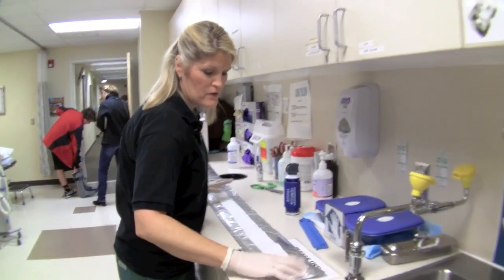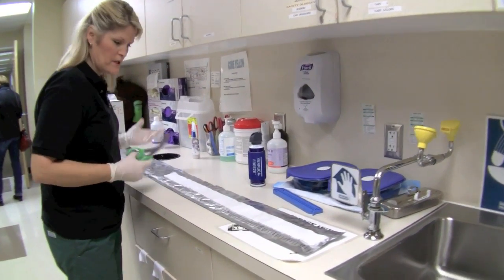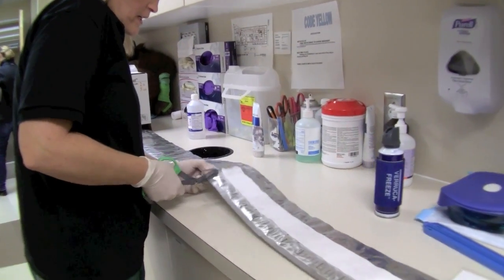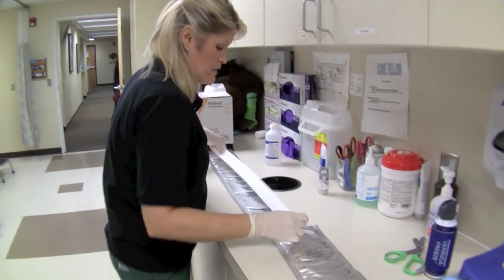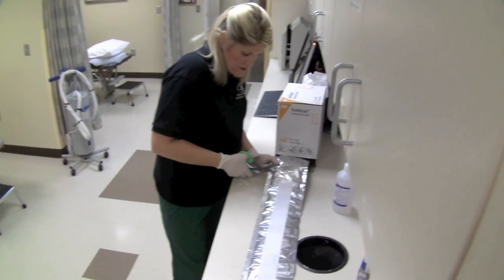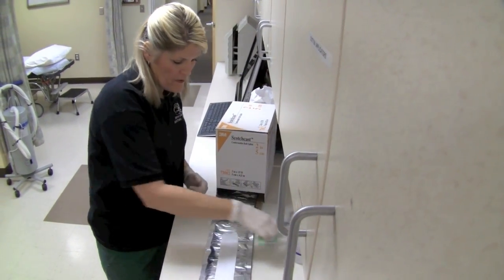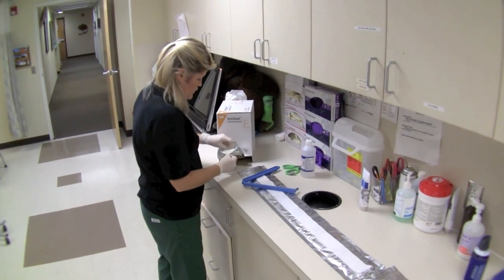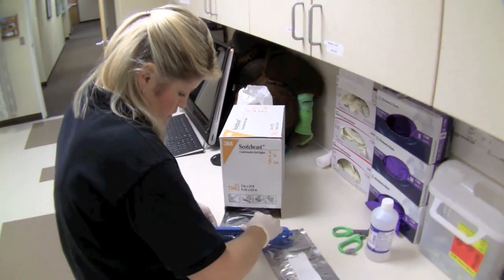We're going to make an L and a U — two pieces. One measurement is laid out and cut for the shorter L piece, then a slightly longer piece is cut for the horseshoe (U/stirrup). The ends are pulled in and trimmed so the material seals well.